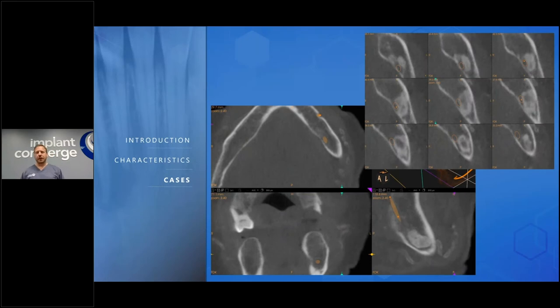So this one's a little more difficult. If you were watching the presentation last week, I actually had this one up. It is idiopathic osteosclerosis, but if you notice all around that mandible in the soft tissue, look at all that calcification, and it's all squiggly, worm-like. Now, we don't have a diagnosis for this, but that is some kind of calcification. A diagnosis would be a phlebolith, which you do find quite often. But definitely, something to follow up with the patient and have a record of those interesting findings is very important.